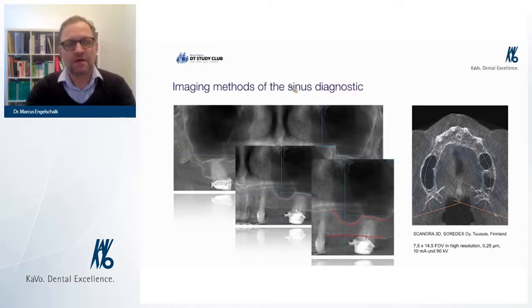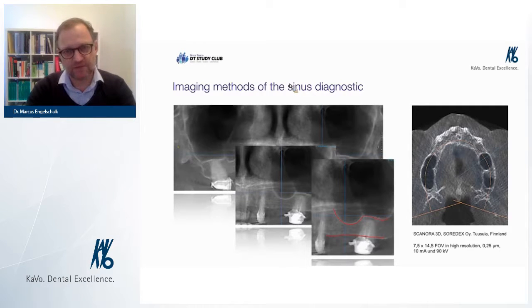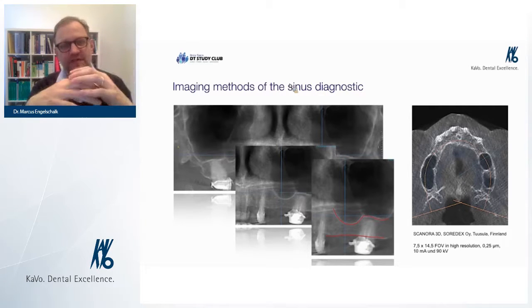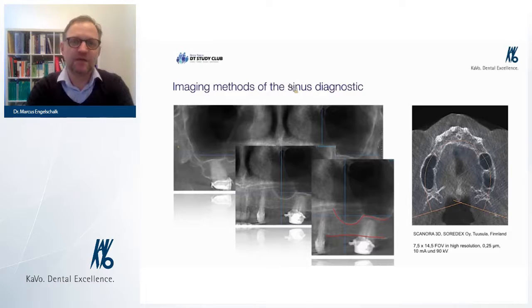Well, we know pneumatization will become more after tooth extraction because we have a bone loss. So we fight against the bone loss after extraction, or with the age of the patient. So often we can augment bone at the apical side of an implant structure, but at the coronal side there is still a bone loss and we have a very long length of the crown. This is something you have to keep in mind if you're planning the number of implants and the amount of augmentation.